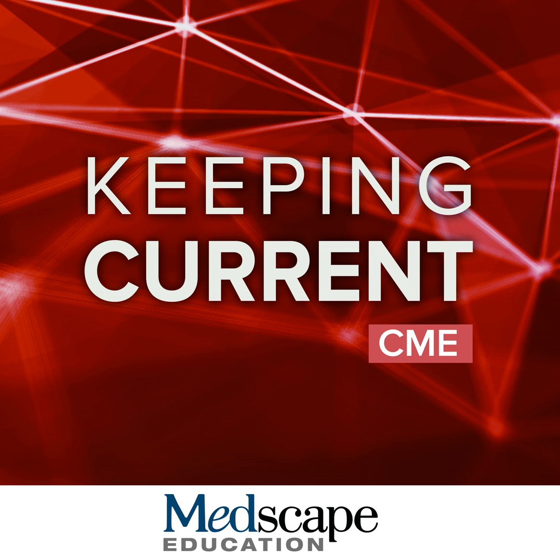So here I'm showing a case of a patient who presented to the emergency room in my hospital with acute chest pain. He was noticed to have negative troponin levels, and also ECG were not specific for any ischemia. Given that chest pain, we proceeded to perform a stress cardiac MRI on him.